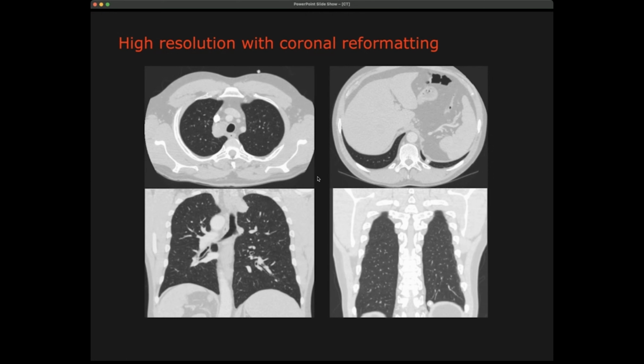But of course, if we have enough slices and these slices are close enough together and the X-ray was thin enough in order to generate relatively thin slices, what we can do is then, of course, reformat, resample the data set, and then look virtually in another direction. And that's actually what's being done with most scanners. So once you have all the slices together, you make a stack, and then with image processing, you can go through it and you can see it in different directions.